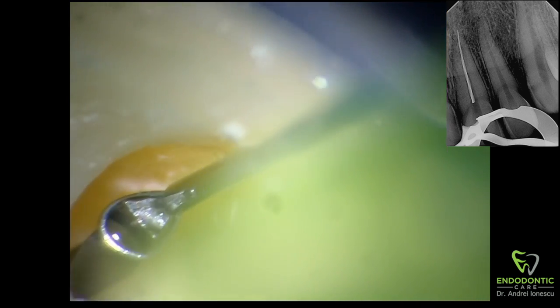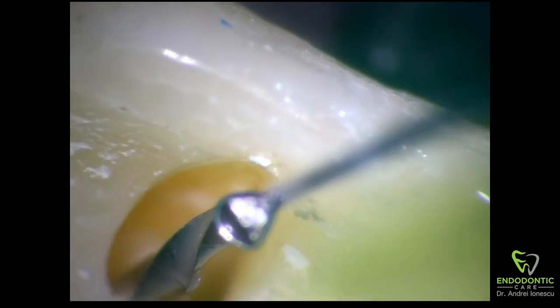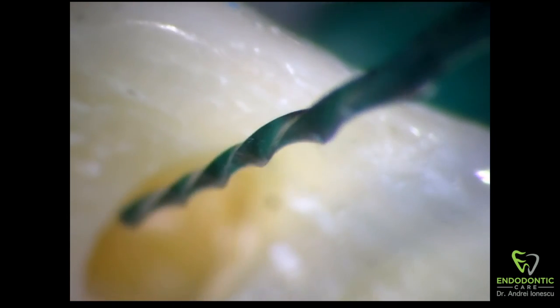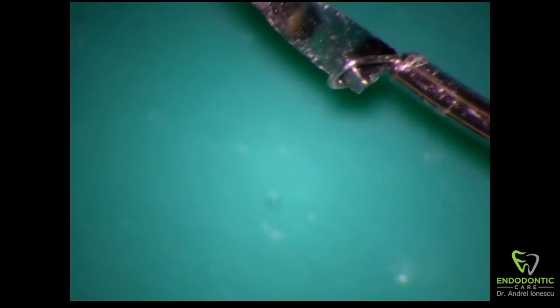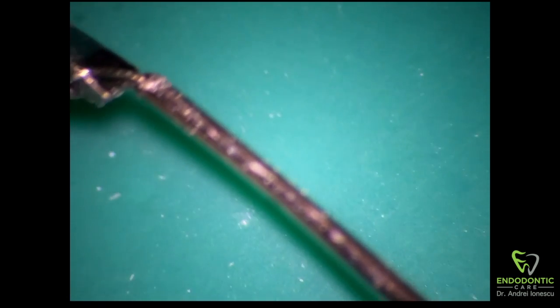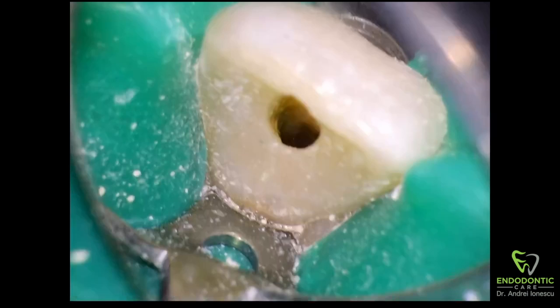You can see the file starting to come out. I'm impressed by how tightly you can grab onto the file and how much force you can use to pull. I actually barely caught two corners of that file and it was enough to get it out. A very nice tool, very useful, and I'm sure it's going to come in handy for many years.